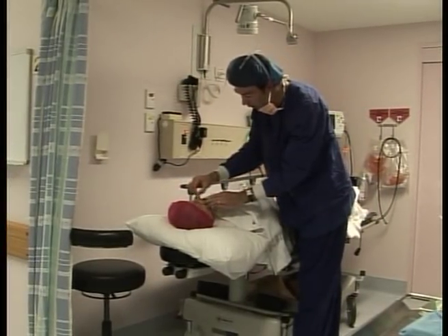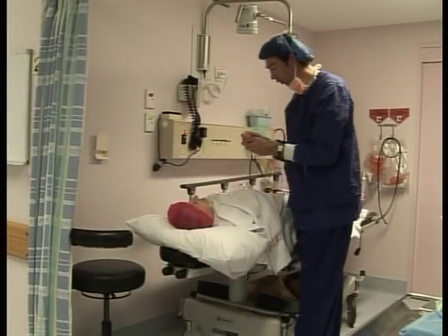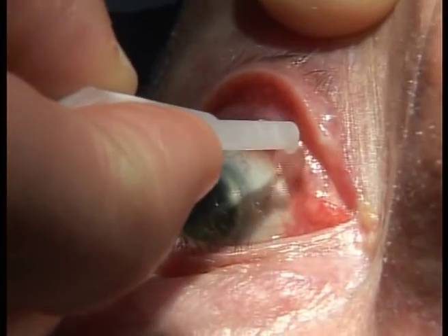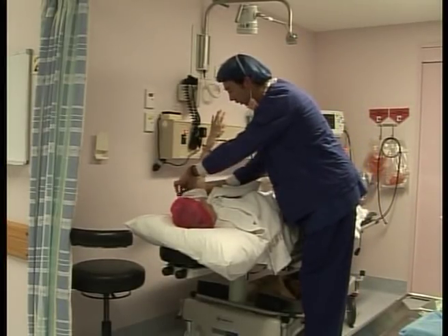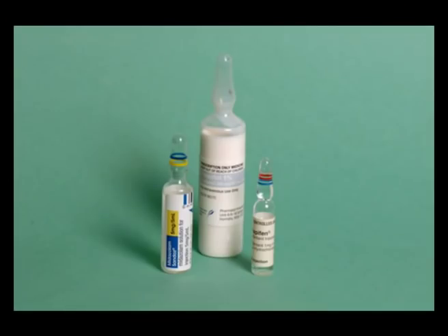Preparation for a Sub Tenons block is similar to that for any eye block. Instill local anaesthetic drops early in the piece. I instill these into the infranasal quadrant rather than directly onto the cornea for greater patient comfort. Insert an intravenous cannula and attach a saturation probe for monitoring. You can use whichever sedation is your preference. Bear in mind, however, that this is a technique in which patient cooperation is very useful in order that the patient can look in the direction that you want them to look.